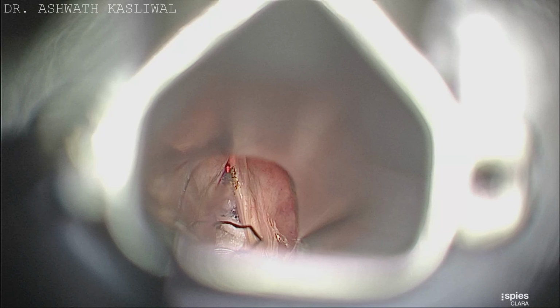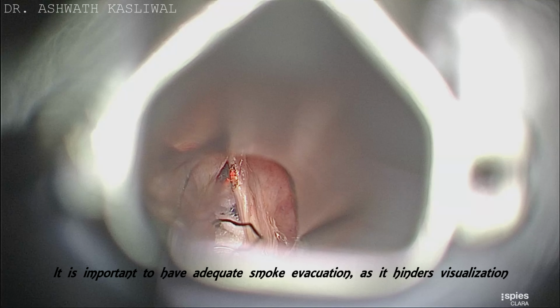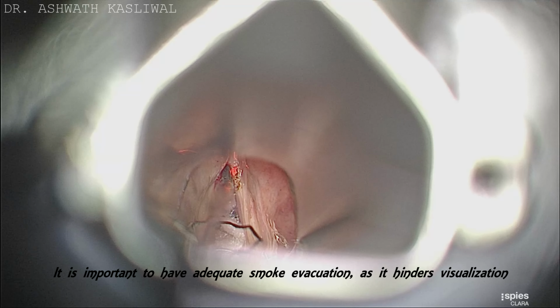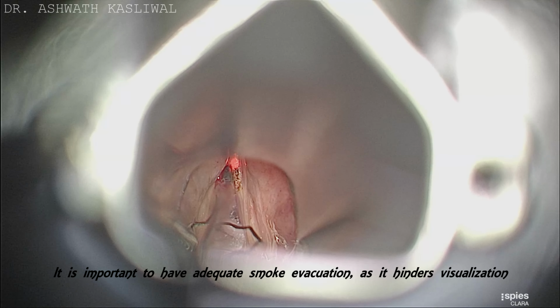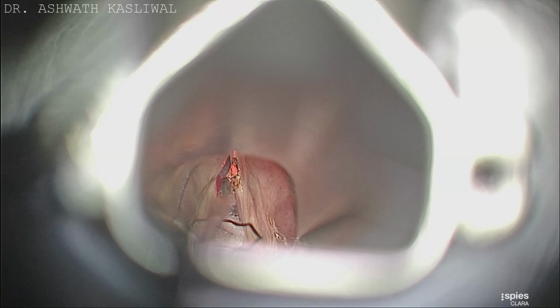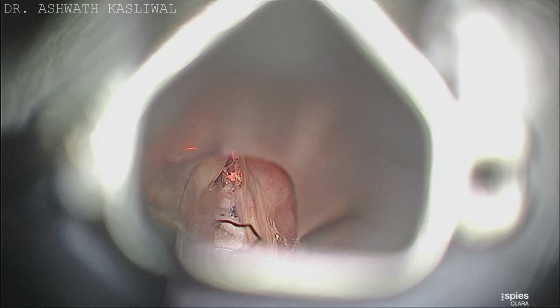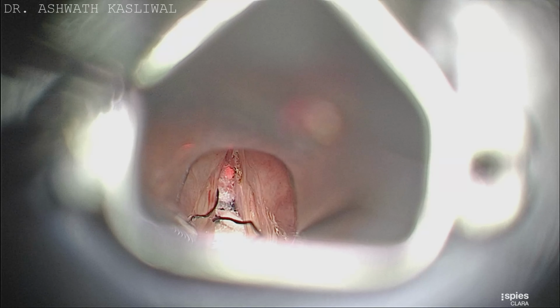While doing the dissection with the laser, it is important to have adequate smoke evacuation with a suction, which may be connected to the laryngoscope, as the smoke from the laser leads to poor visualization and thus difficulty in removing the lesion.